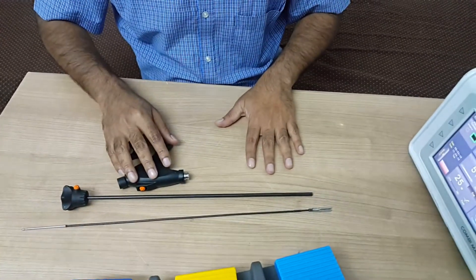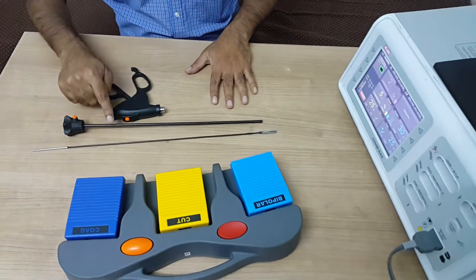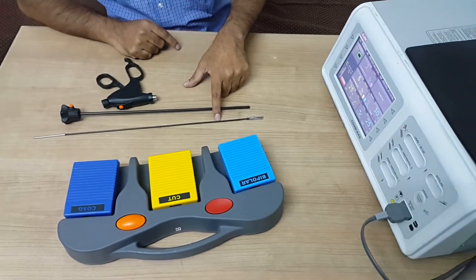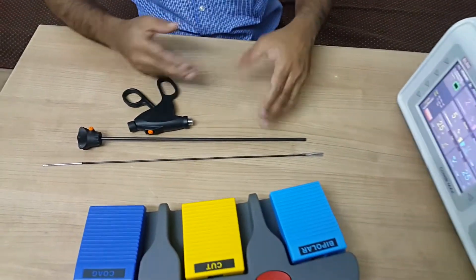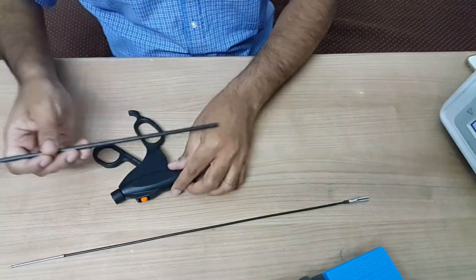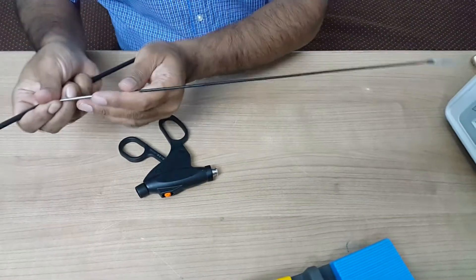This is Allen's 3-part 5mm reusable vessel sealing instrument — handle, shaft, and insert. The insert you may have to change after 30 to 60 cases, depending upon wear and tear. The handle and shaft are reusable. Now I will show you how to assemble the instrument.